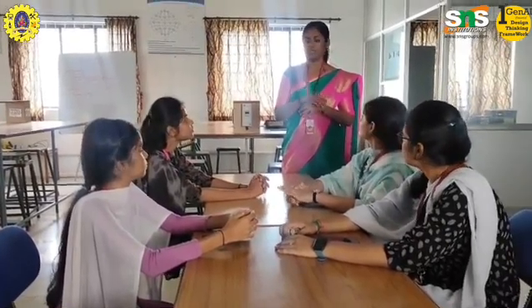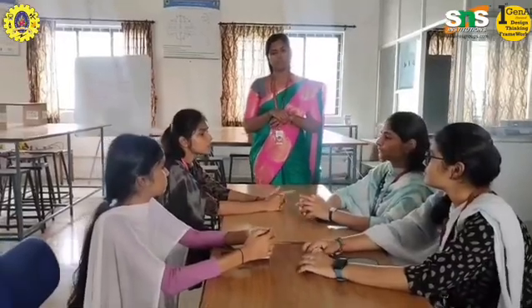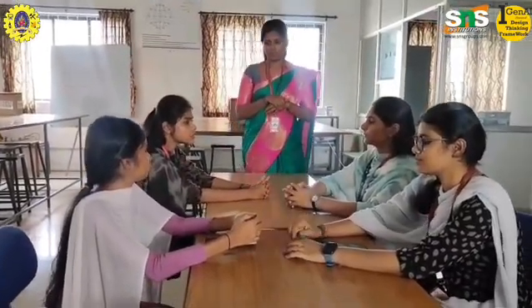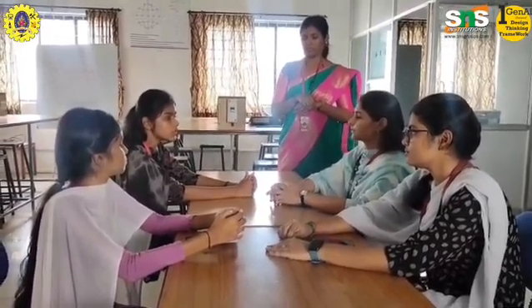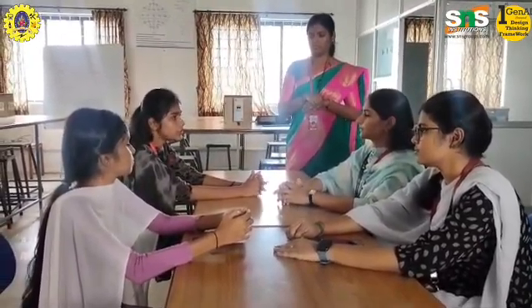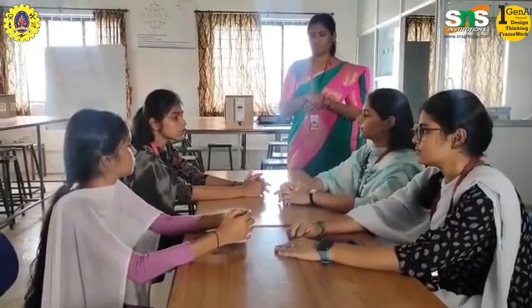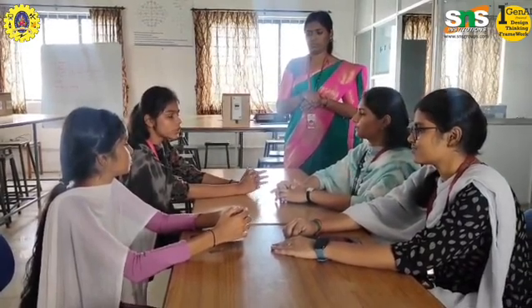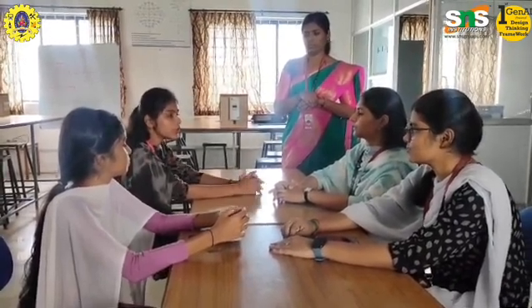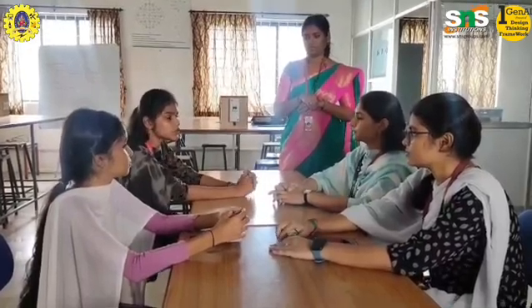Yes, what Prakshita said is right. Is there any counterpoint for Prakshita? So I would like to share some advantages of ultrasonic diathermy. The first one is deep tissue penetration, the second is that it is a non-invasive and painless method, the third is that it increases blood flow to recover pain, and the fourth is that it reduces pain and stiffness of joints and muscles. So these are the advantages of ultrasonic diathermy.